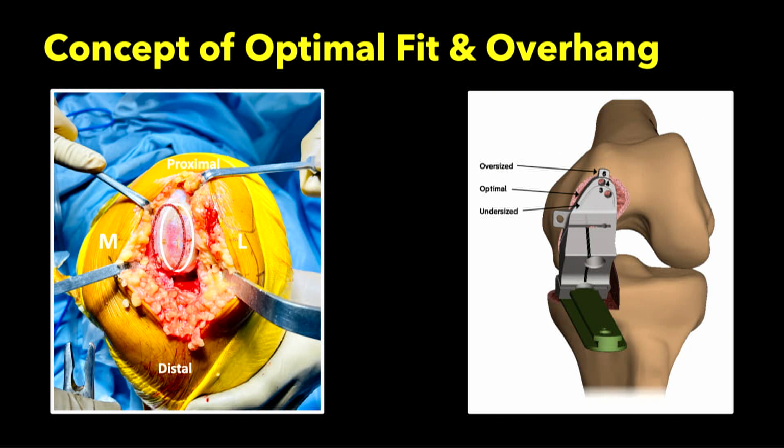In scenario 2, anterior overcoverage would lead to patellofemoral stuffing and increased anterior knee pain. The third scenario, which is the lesser of the 2 previous evils, is undercoverage, where part of the eroded cartilage is not covered, and that would cause reduced relief of knee pain.